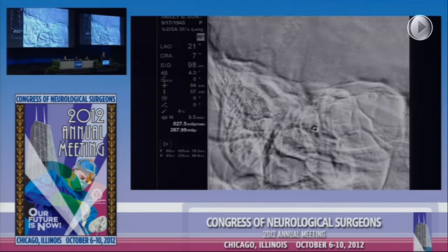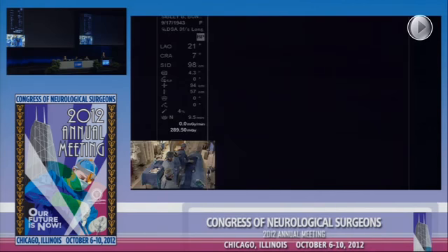Excellent. You want to explain why you see a little bit of movement, Elad, with an awake patient? Yep, she's awake. She's very cooperative. She's a little bit of a heavy breather. Can you clean that up, Gene? And let's fake that. We're going to start going up with our micro apparatus. So we have a Marksman catheter, which is a catheter designed to put this flow diverter through, and the gold tip Aladdin wire.